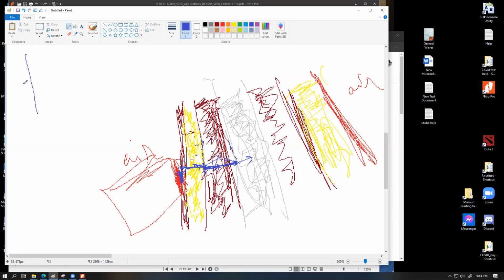And the way this thing produces ultrasound, one way I can show you, though this figure is not drawn to scale. Let's say this is the amplitude versus time of the fed ultrasound. Let's say we send one pulse of very high frequency, and then we don't send anything. So then what's going to happen? We're going to detect multiple reflections along the path.